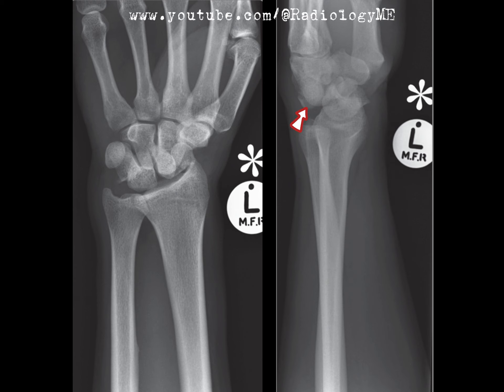This is classic for a dorsal dislocation of the capitate. Now if you take a closer look at the scaphoid, you'll notice a fracture right through the waist of the scaphoid. This combination of findings — the dislocation of the capitate and the scaphoid fracture — gives us what's called a trans-scaphoid perilunate fracture dislocation.